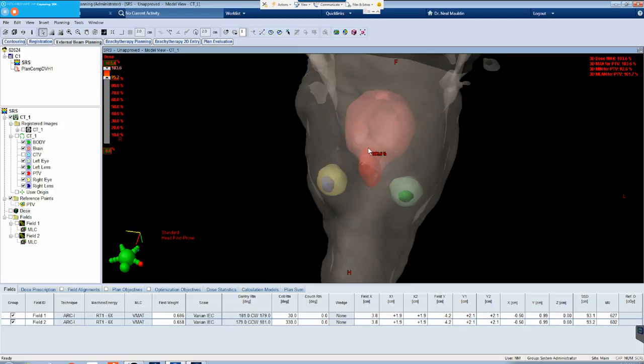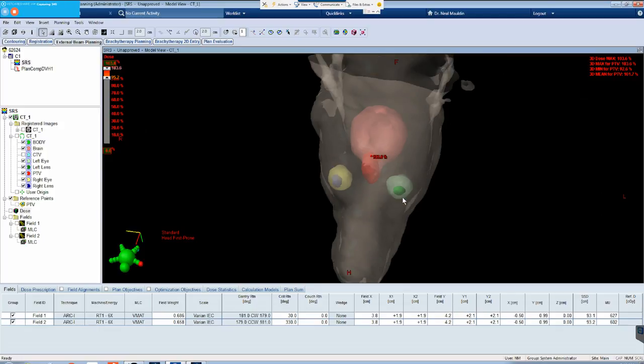significant clinical signs. Certainly we can see much more severe signs if we had a tumor here in the midbrain where the thalamic core lives, or perhaps an even more dangerous location would be in the back, in what we call the caudal fossa, because those patients can get into trouble due to high pressure. So it's a good place to have a tumor from a normal brain function perspective, but you can see we're tucked down in between the left and right eyes, so we're going to have to work a little bit to treat this tumor while sparing the normal structures that are surrounding it.